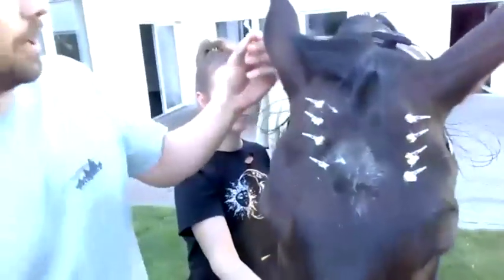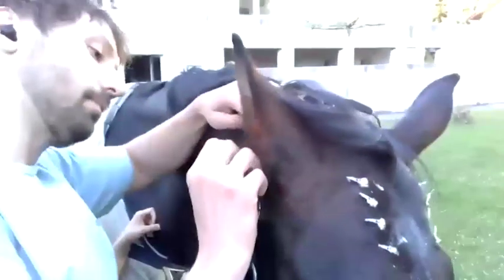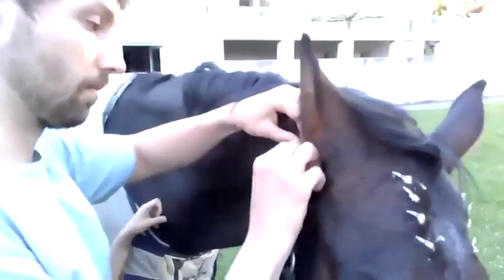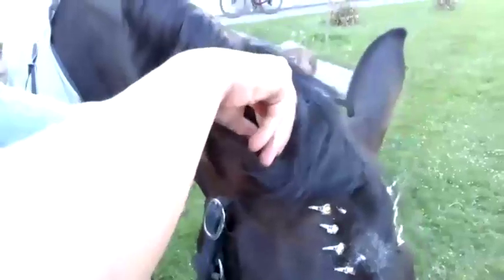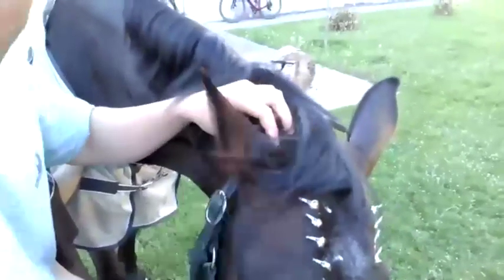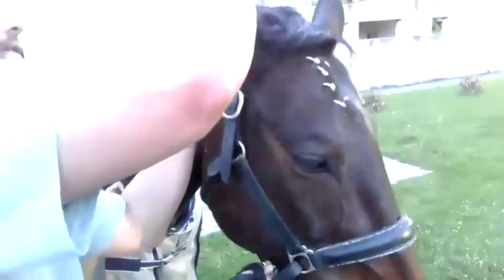And now I'm going around. I'm placing it in the position behind the ear. Higher, because we could reach the muscle with that, which is not good, because then we would have a lot of muscle activity here on the ground.